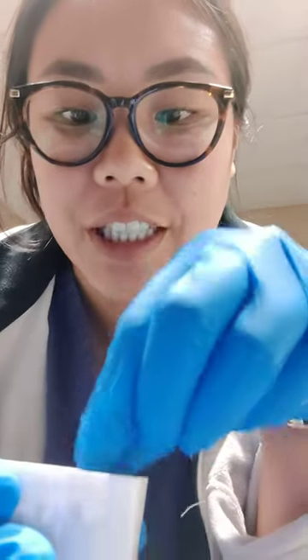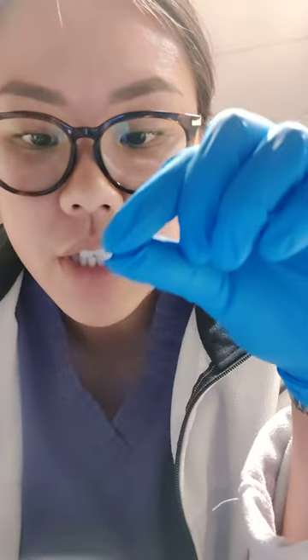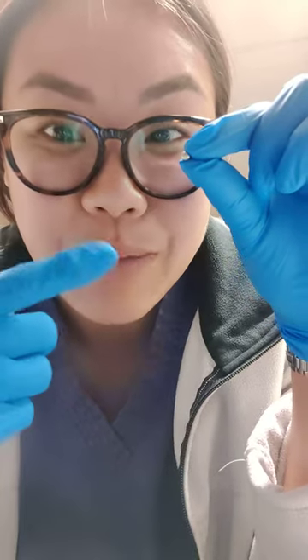We're going to go over some BB stuff. And these are markers. There's different kinds for every facility. This facility actually has little BBs that go in the BB guns. And anything lead is fine.